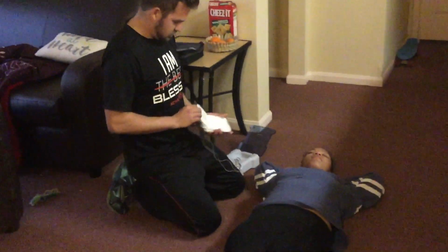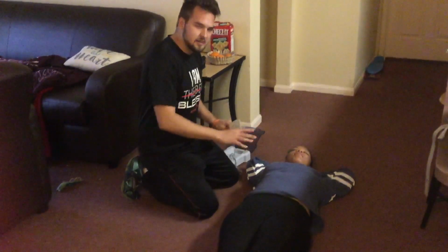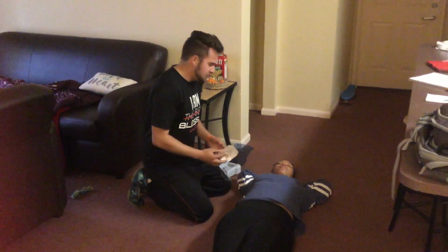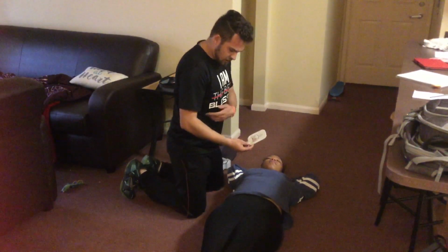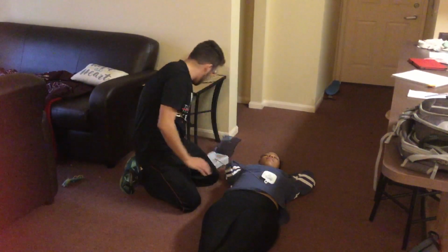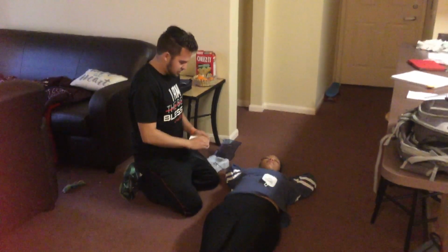Onto the patient's bare skin. With that bare skin, if there's any wetness, you want to dry it off with a towel or any kind of thing you can use to dry off the skin, to make it easier for the AED to work. So this one shows right above, right on the ribs. So put it here, as well as the other one right on the upper right chest.